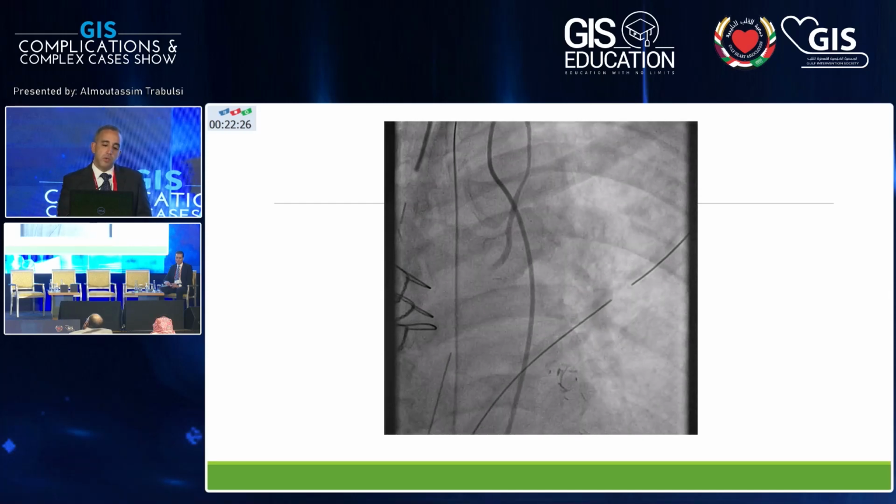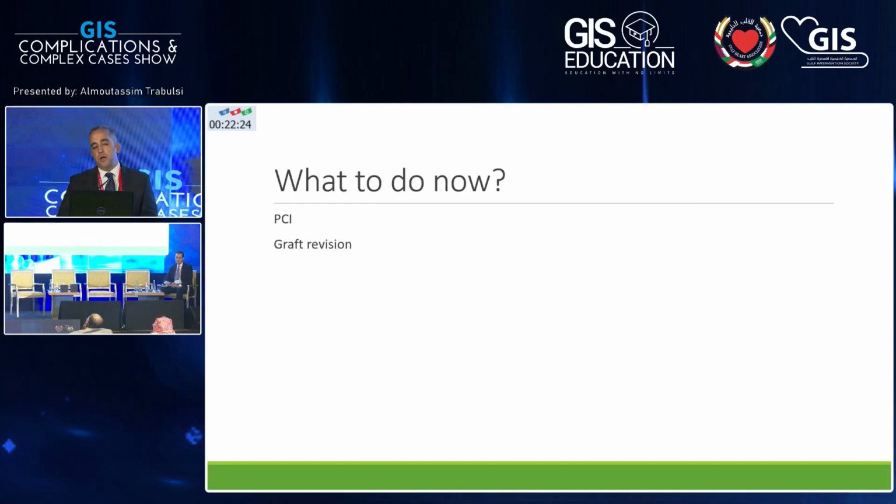So at this stage, our surgeon was in the cath lab, and we had a lengthy discussion about what to do next, and I'd like to hear your opinion of what we should do next. So he's on Levophed right now, increasing dose of Levophed. Yes. At what doses, and is there? He's almost maxed out on the Levo.